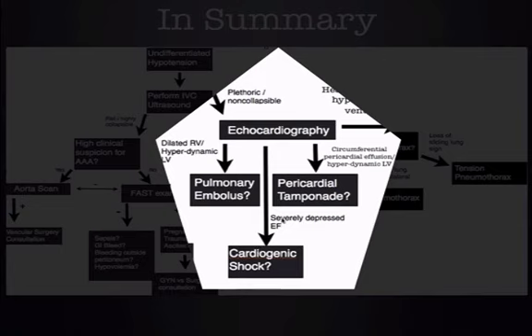You need to go ahead and get inotropes on board, as well as your fluid resuscitation and vasopressors. If there's a circumferential pericardial effusion with a hyperdynamic LV, in addition to a plethoric non-collapsible IVC, then you assume pericardial tamponade. You pull a pericardiocentesis tray to the bedside and mobilize consultation versus transport to a facility that can provide pericardiocentesis.